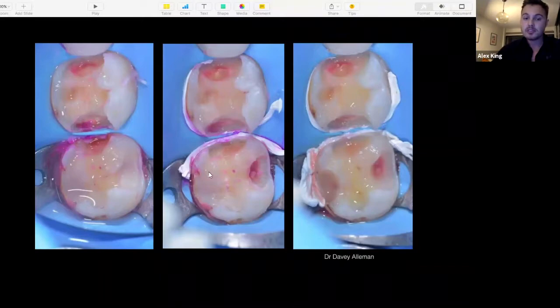Again, look at this buccal cavity. The removed material is all composite there, I presume. Here, a more purpley hue, dark purple. Remove the outer carious dentine, and here it's lighter again, and that's got a resin coat on as well. So they've selectively removed outer carious dentine, which is infected dentine, so they have predictable bond strength. In every biomimetic restoration, you should really leave inner affected dentine, the one that's slightly pink, because at the end of the day we're being as preservative for the pulp as we can be, but still maintaining at least 30 megapascals of bond strength.